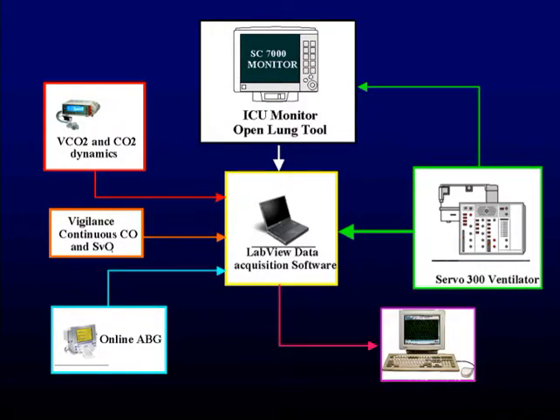Well, from theory to praxis, it is difficult at the bedside to follow the dynamics of recruitment and lung collapse. So there's no specific monitor that helps us or guides us through all these procedures. And we are evaluating the Open Lung tool, which is software developed by Siemens integrated in the multi-parameter monitor.